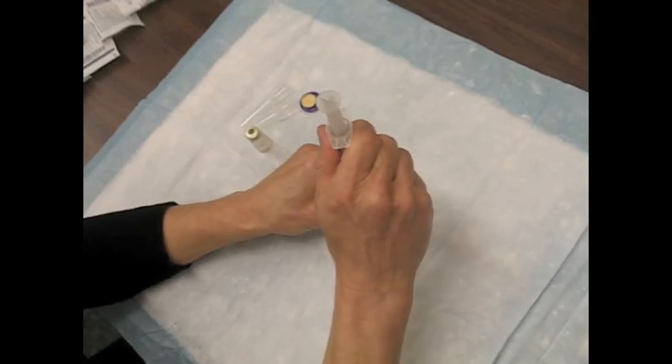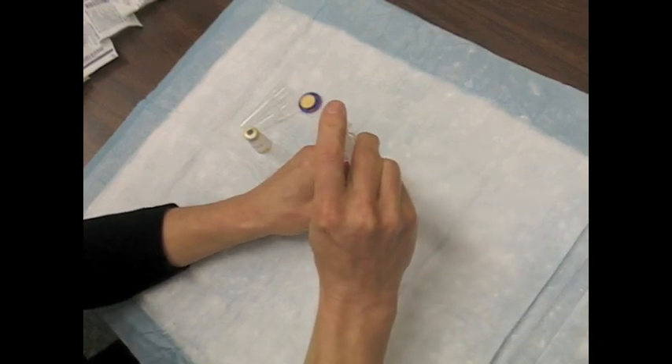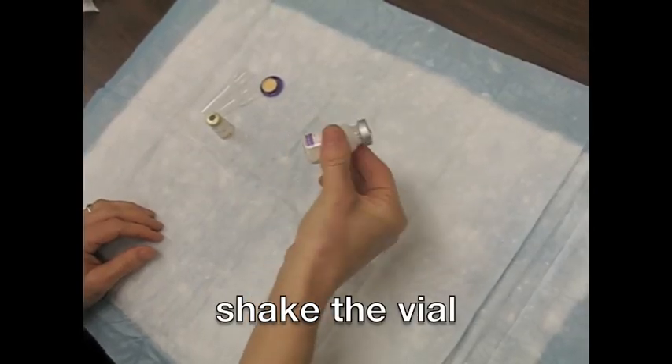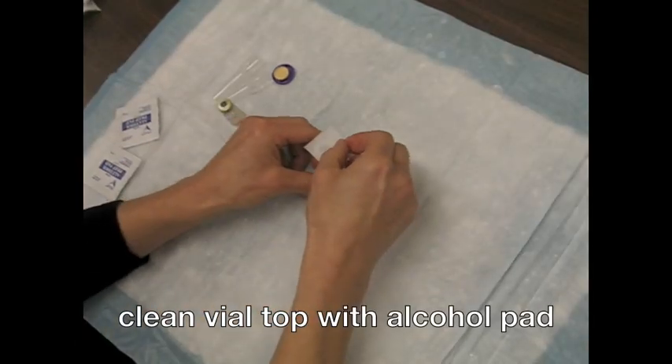For the second step of reconstitution, the adjuvant is injected into the vial containing the antigen suspension. The mixture should be well shaken. The mixed vaccine is a whitish emulsion. If any other variation is observed, discard the vaccine.